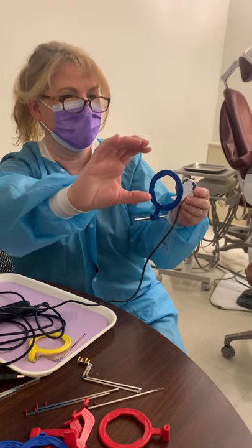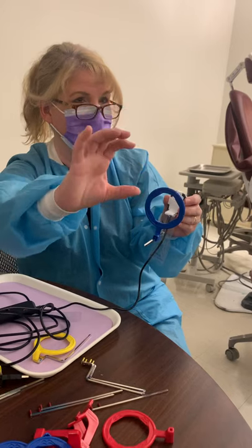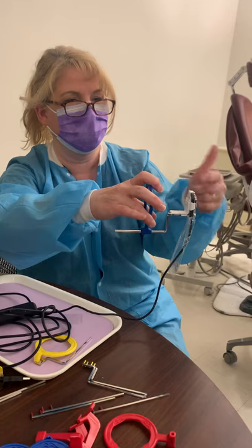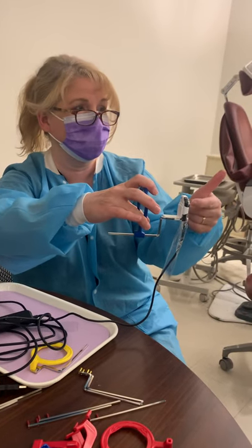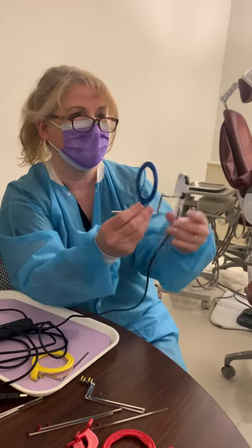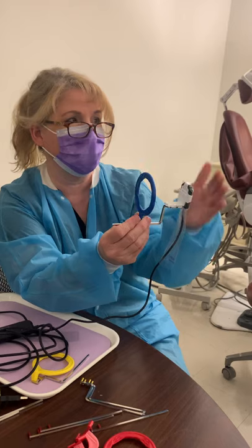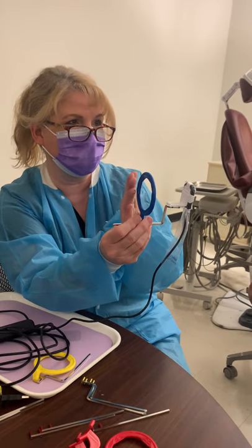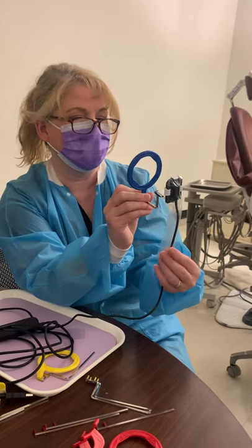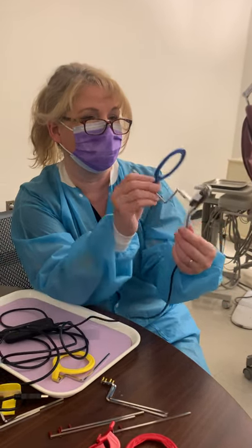This is an aiming ring. The tube head has a cone off of it called the PID — positioning indicator device. We line it right up to the ring, and then the beam comes straight out and hits our sensor, whether it's a film sensor or PSP sensor. That's the whole concept — this holds it in the patient's mouth and holds your sensor parallel to the teeth.